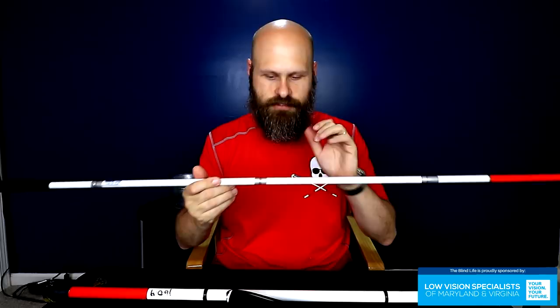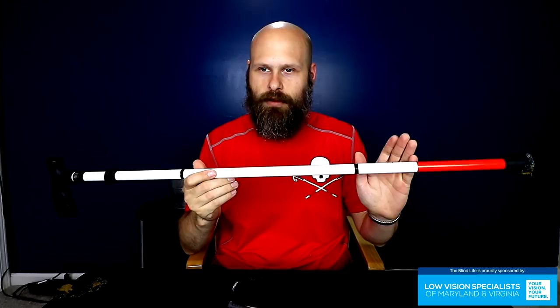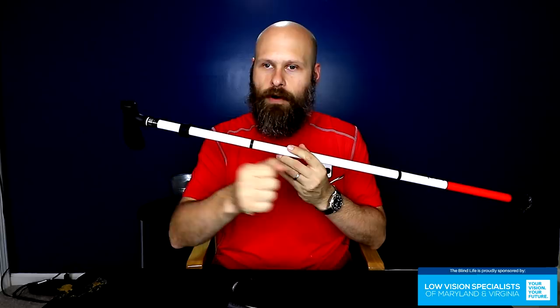Now canes come in all different shapes and sizes. This is a stability cane — the kind that if you have some limited mobility, maybe an older person who needs a little help walking but still wants a cane that is identifiable as low vision, this is perfect for that. This would not be used for navigation; this is strictly for identification because it's a mobility cane.